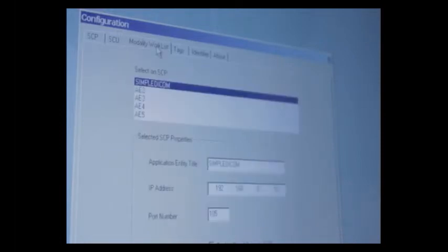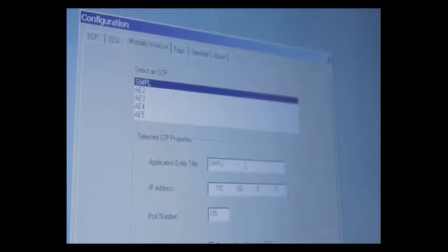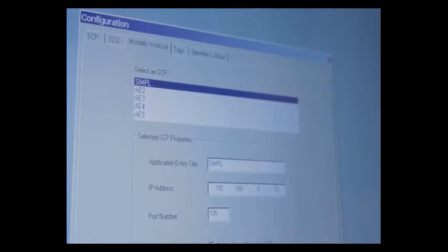The Modality Worklist tab is going to be the information from your Modality Worklist server. Again, simple DICOM is the default, so backspace this information out. Enter the IP address of your Modality Worklist server, the port number, and make sure that the enable send query to SCP box is checked.